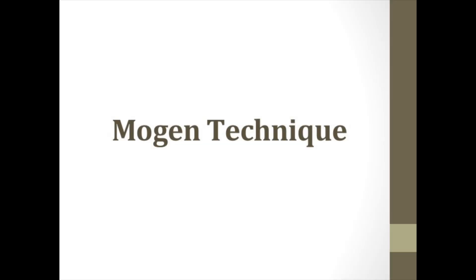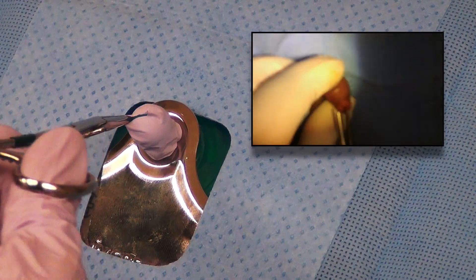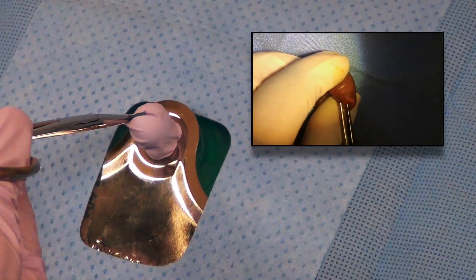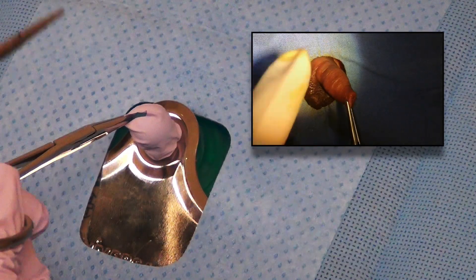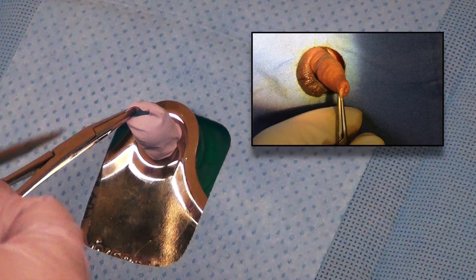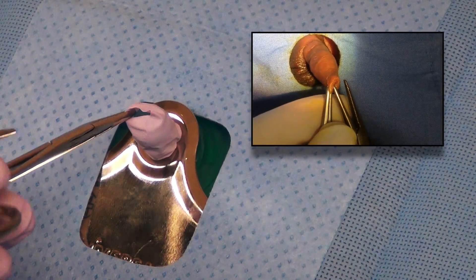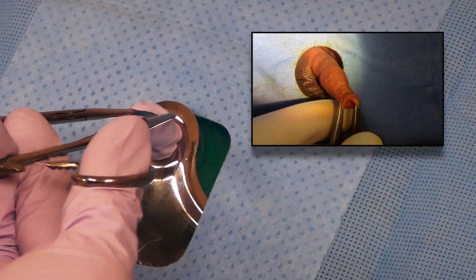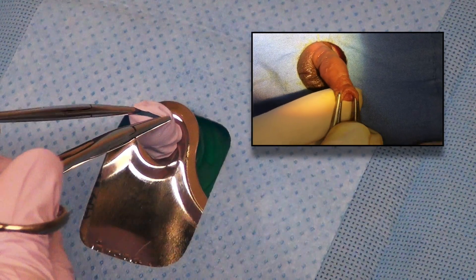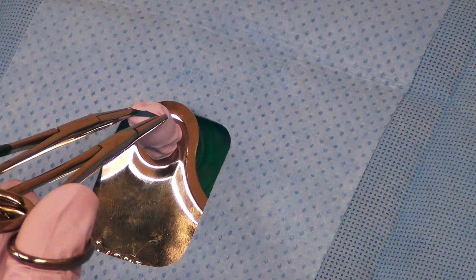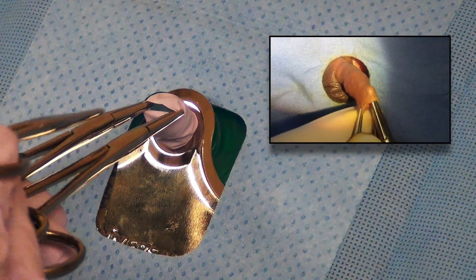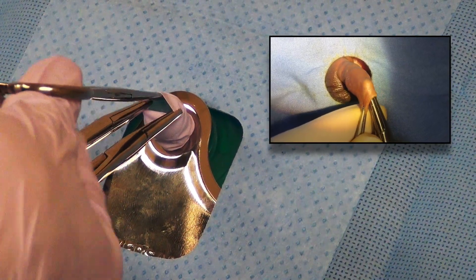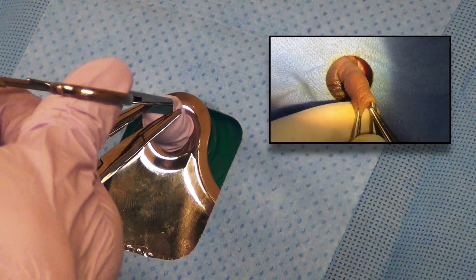First, we will review the Mogen clamp technique. The opening of the foreskin is grasped at the 3 o'clock and 9 o'clock positions.